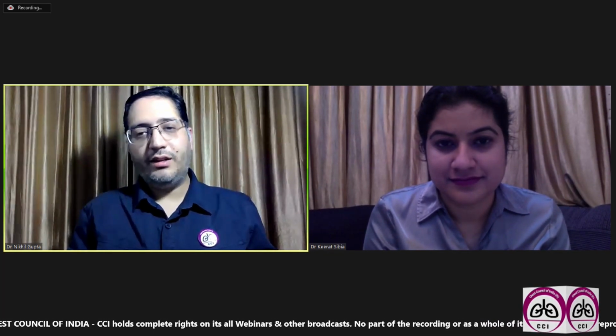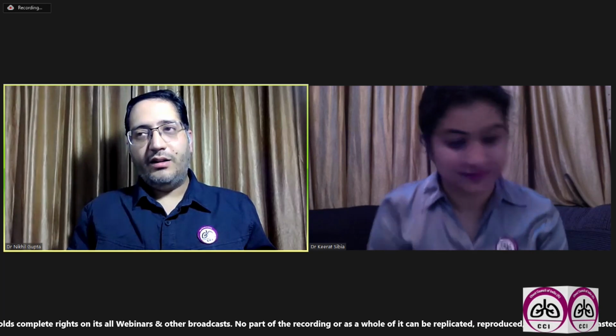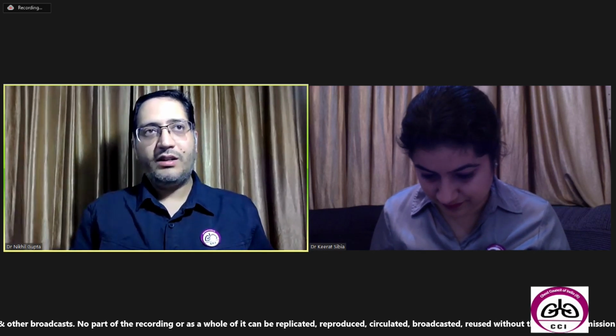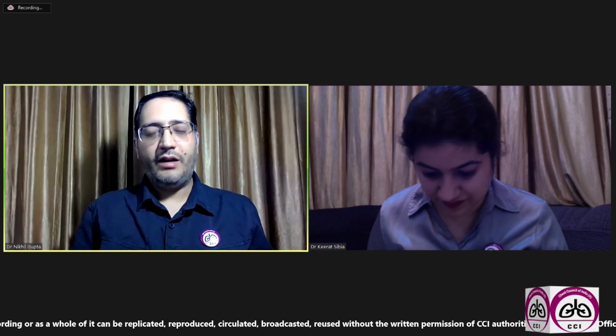Apical pleural thickening is most commonly seen in tuberculosis. And sometimes the apical cap is normal. So it is less than 5 mm, I think, and it can obscure a mass in the apex.